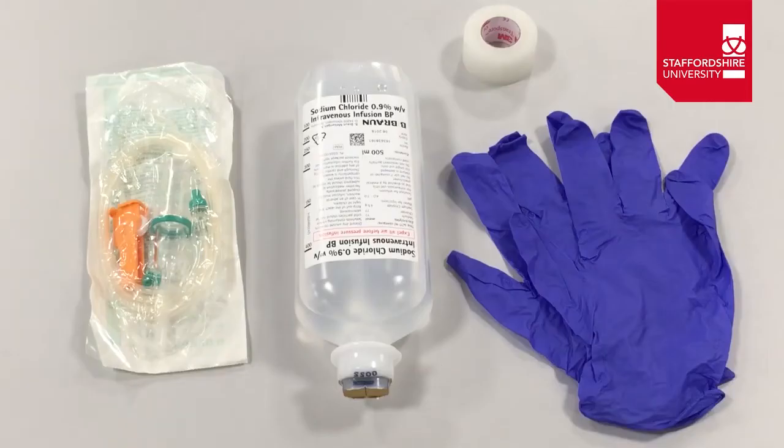To do that, as you can see, we have all the equipment that we need. We have an IV giving set, we've got the fluids that we're going to administer, we have gloves for infection prevention and control, and we've got some tape to secure the tubing once we've connected it to the cannula.